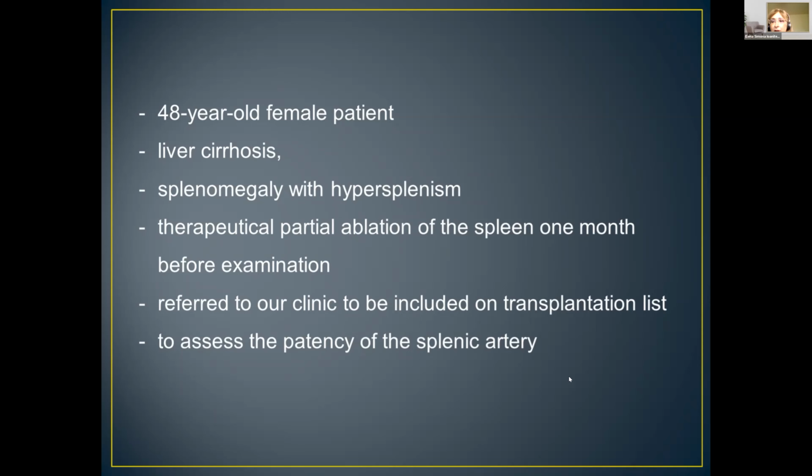Our examination was centered on proving the patency of the splenic arteries, because for liver transplantation, one of the important conditions is the patency of the splenic arteries.